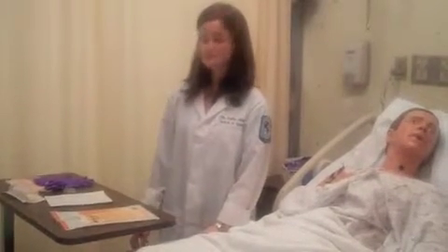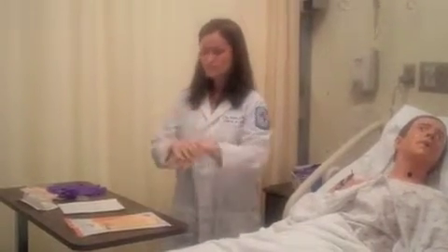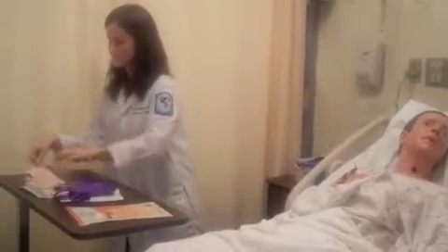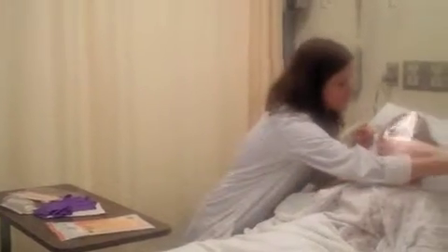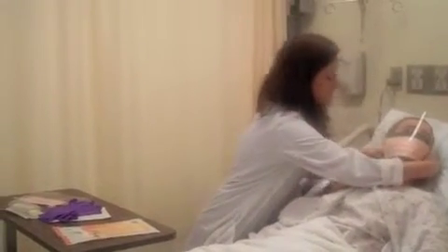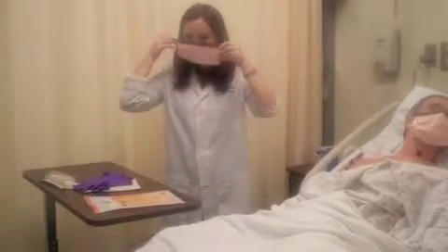Hi, my name is Danielle. I'm a nursing student, and I'm going to show you how to do a central line dressing change. First, the nurse will perform hand hygiene. Then apply a mask to the patient, and have them angle their head away from the nurse. The nurse will now put on her mask and apply clean gloves.